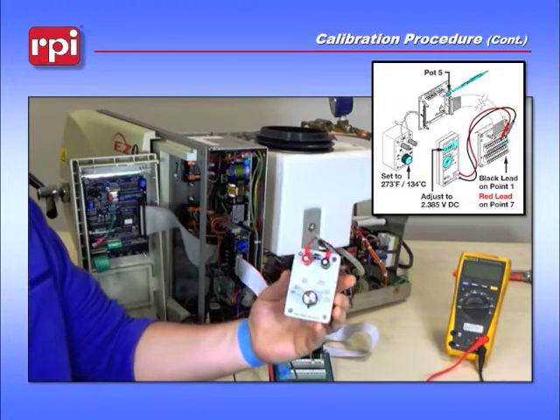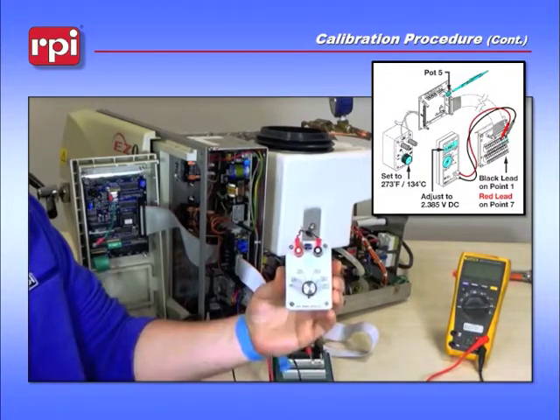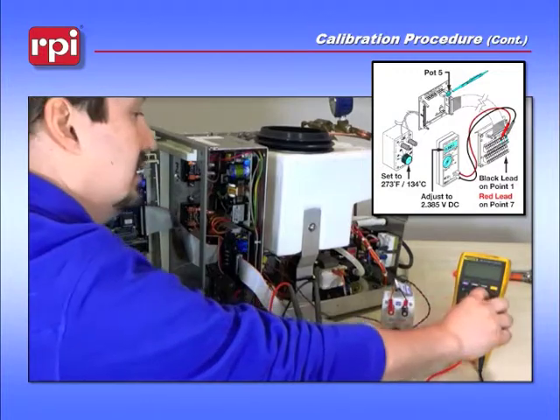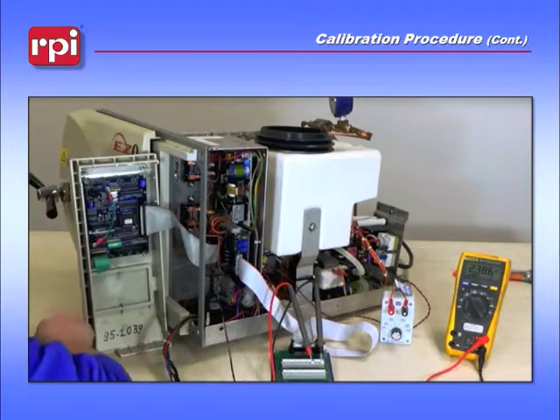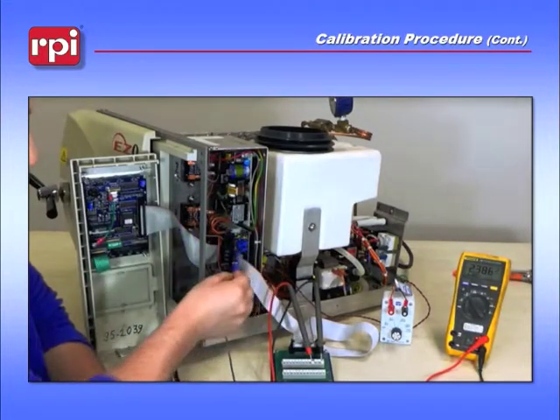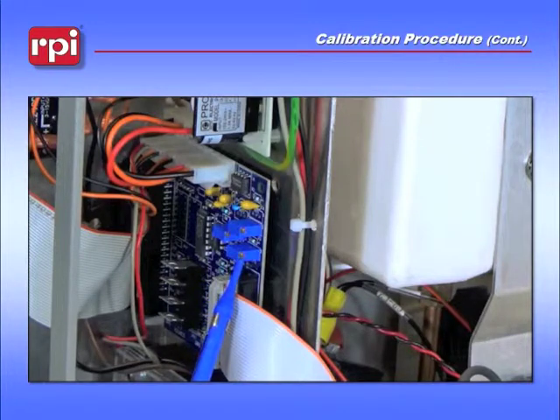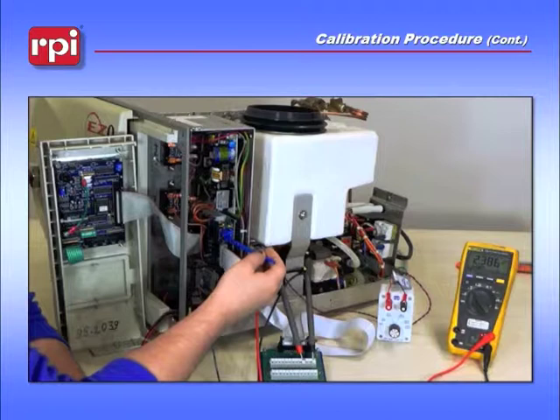Take your TUT-114 and turn it all the way over to 273 degrees. Then take your multimeter and turn it to volts DC. Grab your RPT-460 and adjust pot 5 on the Adjunct 3 board. You want to adjust pot 5 to 2.385 volts.